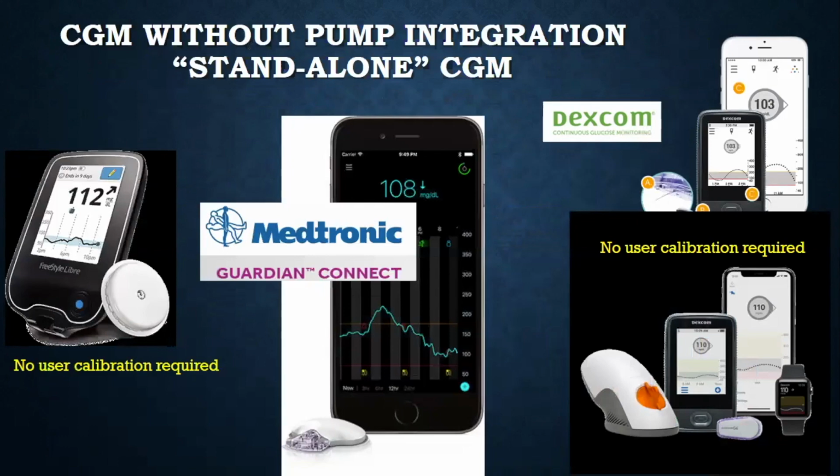So the patient will put the round sensor on the back of their arm and use the device here. They'll flash it over that and they'll get a reading that tells them their blood glucose level and then a trend, whether it's headed up or down. And this will help them monitor that during the day. The Freestyle Libre does not require calibration. That means the sensor reads the interstitial glucose, but does not need to know what a point of care glucose is to be calibrated. It's done on its own.